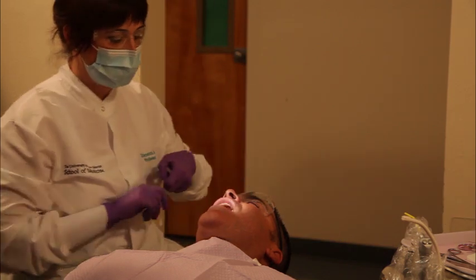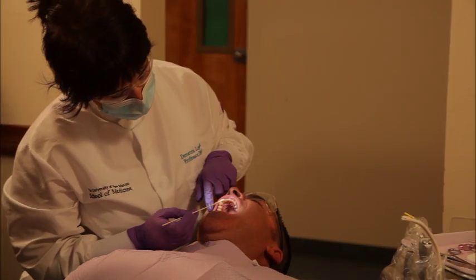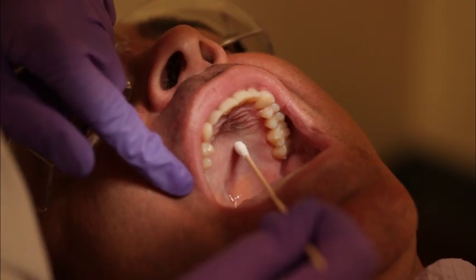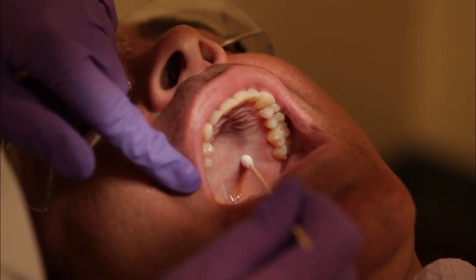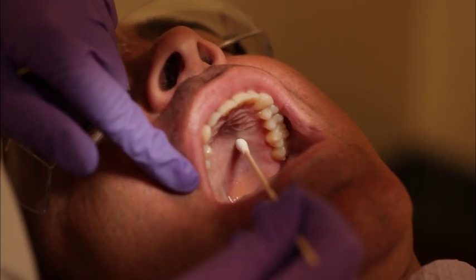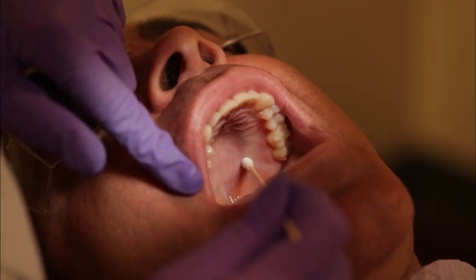Ask the patient to open his mouth and extend the neck either to the right or to the left. Locate the greater palatine foramen by gently sliding a cotton tip applicator along the hard palate surface, beginning at the junction of the maxillary alveolar process and the posterior hard palate foramen near the maxillary first molar, and moving distally until the cotton tip applicator falls into the depression of the greater palatine foramen.